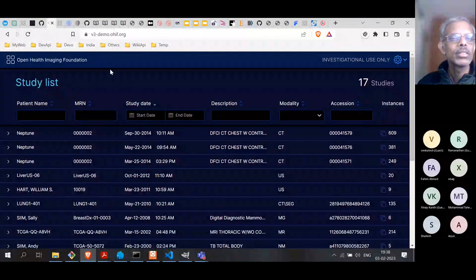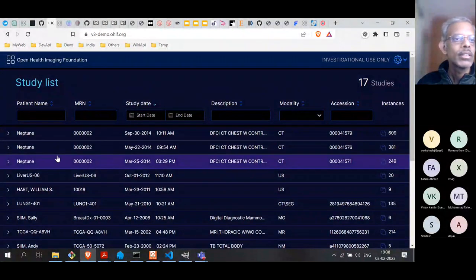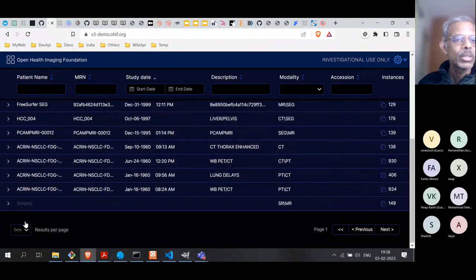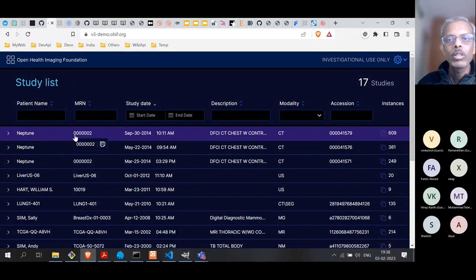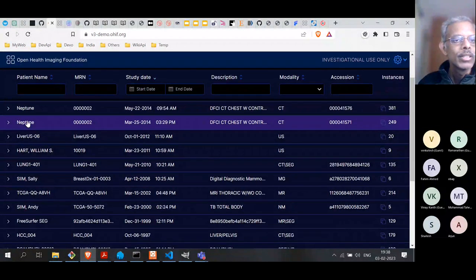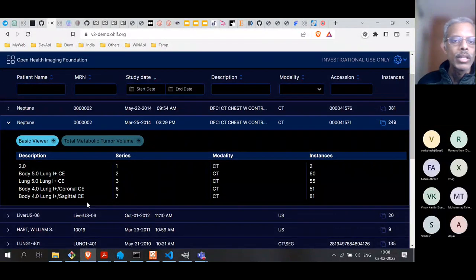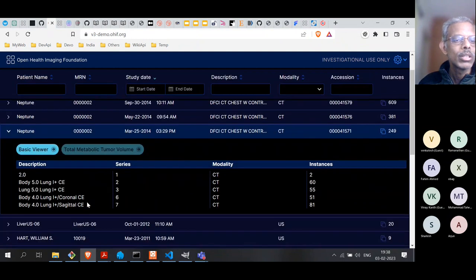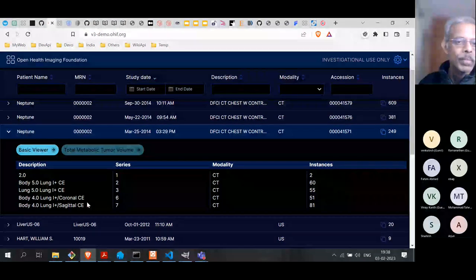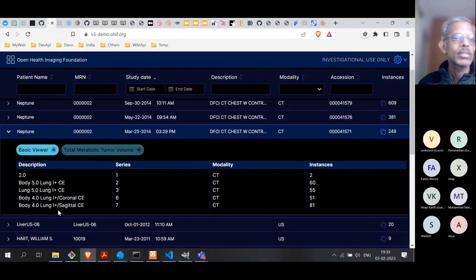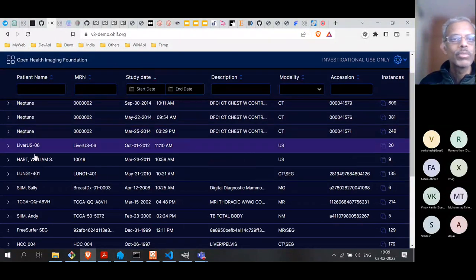When the software loads, you get what is called a study list — a list of items where each one is called a study. Every study pertains to one particular patient. If you open any particular study, you'll find that a study has multiple series, numbered 1, 2, 3, 6, 7 and so on. This is because the hospital has likely done multiple scans of the patient, maybe on the same day or over days or weeks. There is also a start date and end date, so you can do some filtering.